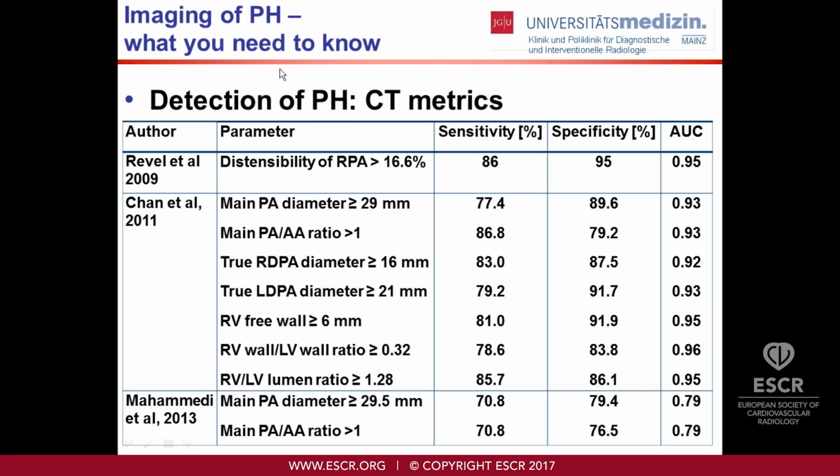And this is not only true for MR imaging, which is basically a functional imaging technique, but also with newer CT techniques, especially with perfusion CT, what we now call spectral CT.